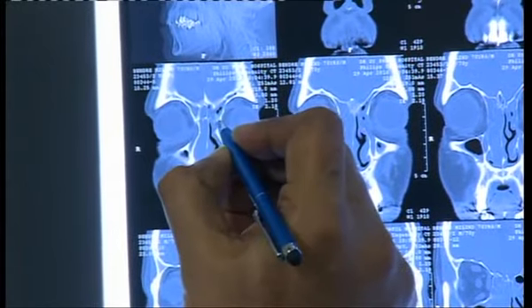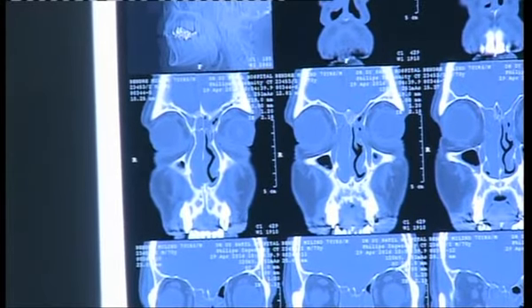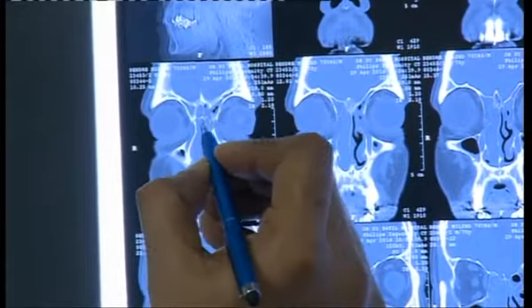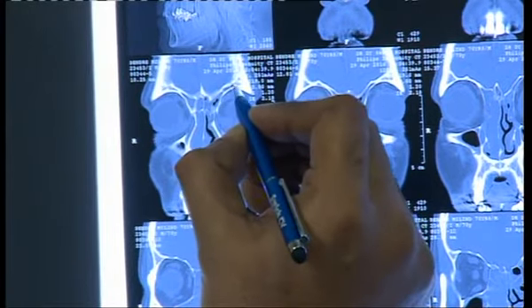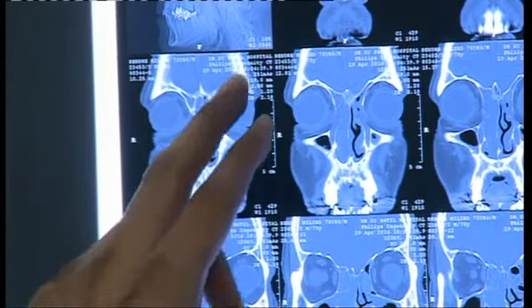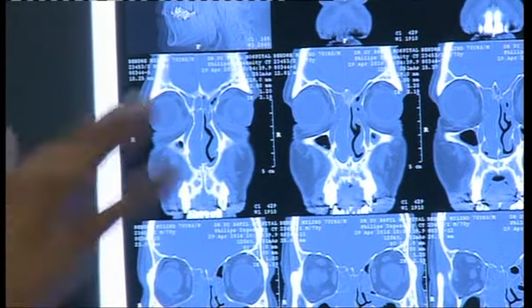Now in this section, if you see, there is no frontal sinus. You need to know what is the frontal recess. Now, when the frontal sinus ends, the floor goes. This is the beginning of the frontal recess. This is just the beginning. And see whatever pneumatization is going laterally at this level. When the floor has gone, the maxillary has appeared, and the pneumatization is extending laterally, looking like frontal, it cannot be frontal. It's the recess now.